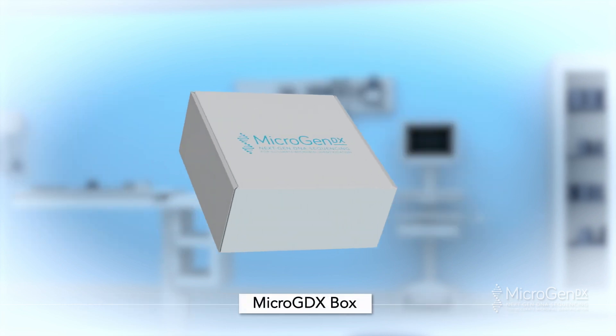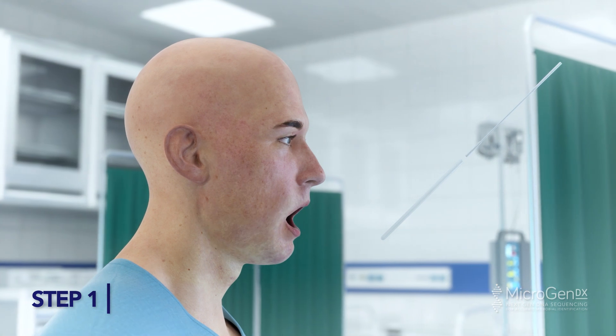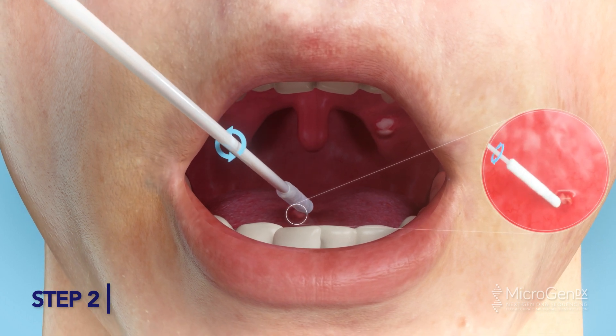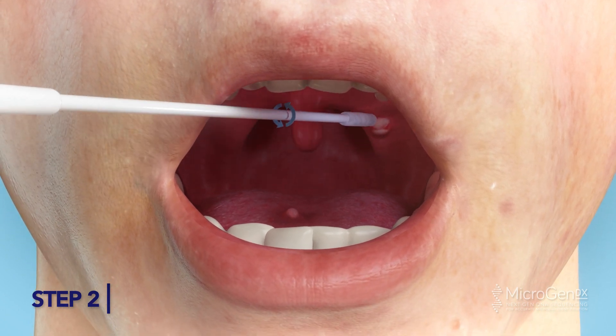Oral swab method. Step 1: This sample must be collected by a trained professional. To open the swab, twist on the dotted line and pull out. Step 2: Gently insert the swab in the patient's mouth and swab any visible or suspected lesions. Be sure to rotate the swab all the way around to ensure a full sample.